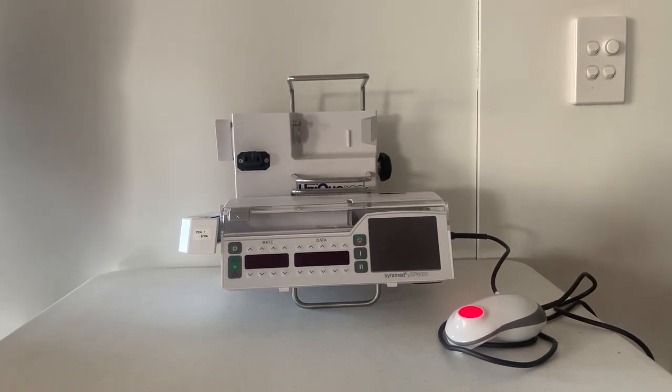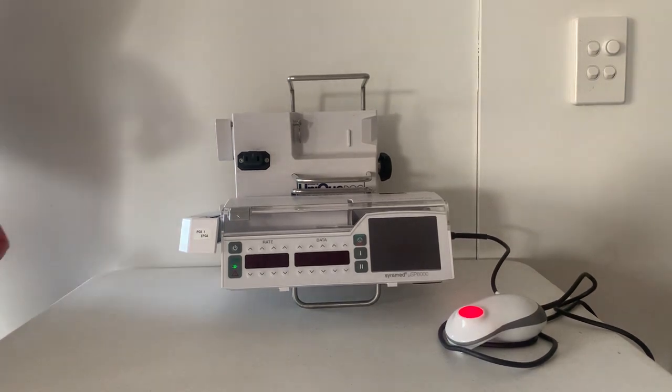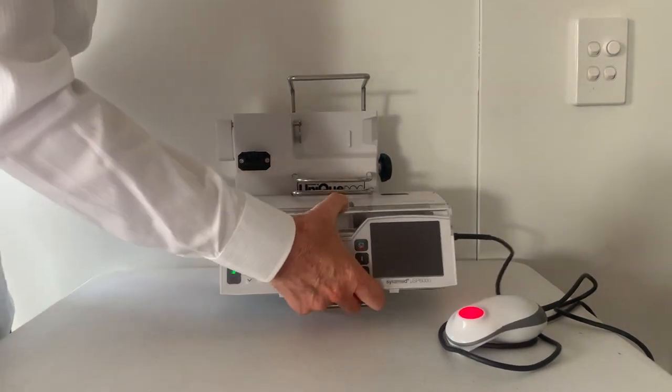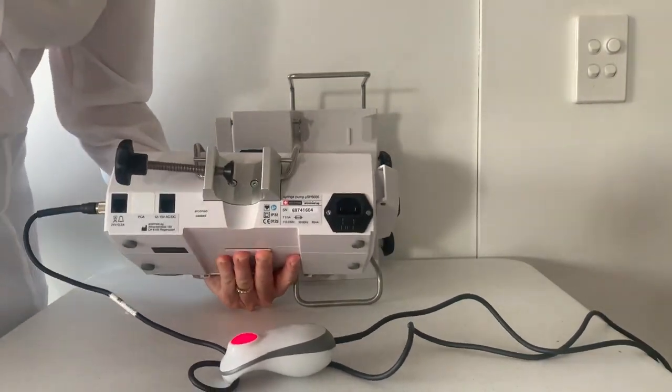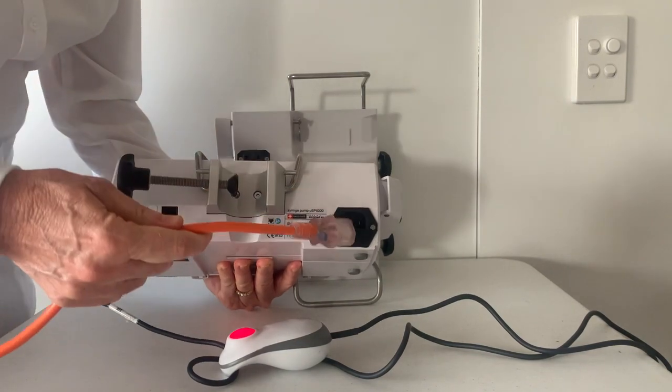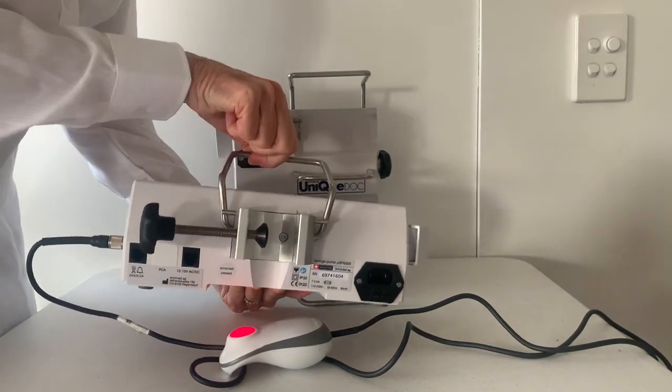The drug library and configuration is developed in consultation with hospital representatives. On the outside of the pump, at the back, it takes a standard power cord. This is the pole clamp and a carry handle.